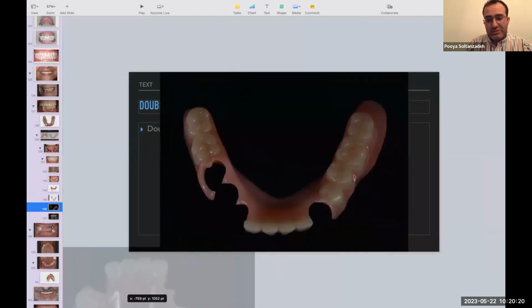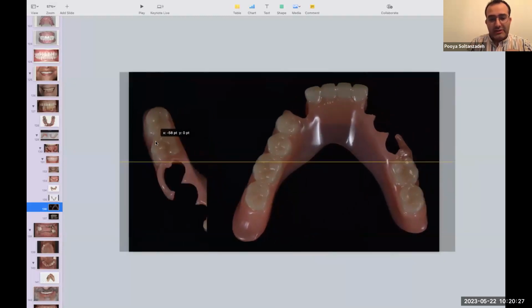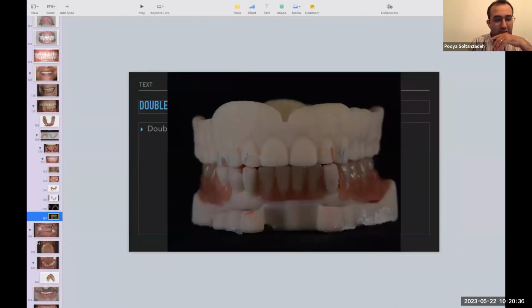They made me a 3D printed partial denture. This is 3D printed. This is not Valplast or something. And it was again reliable and looks very good. This is the case that I said I saw a little thin in some areas, so I was a little afraid that I'm gonna break it. And this is how it's gonna look like.